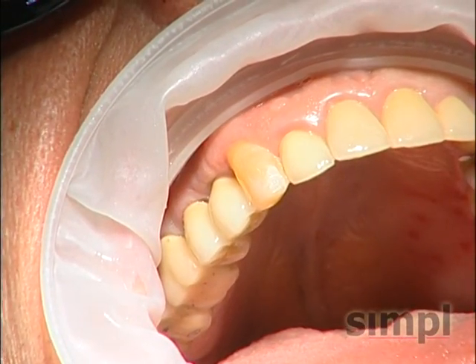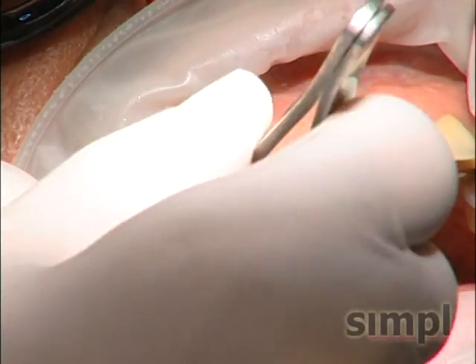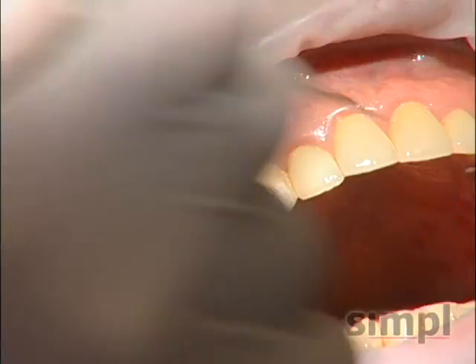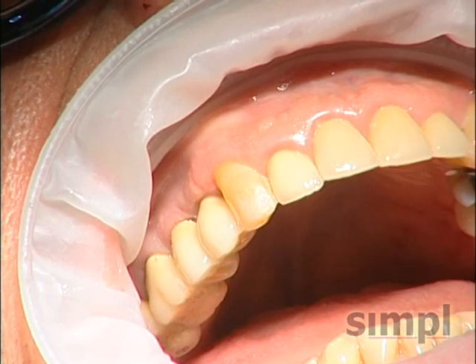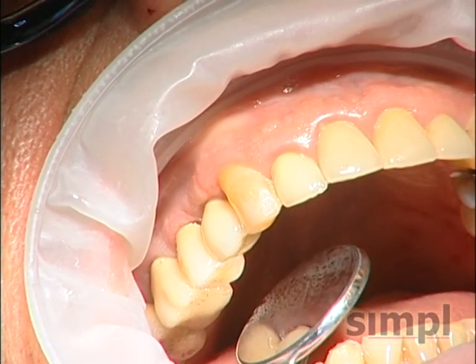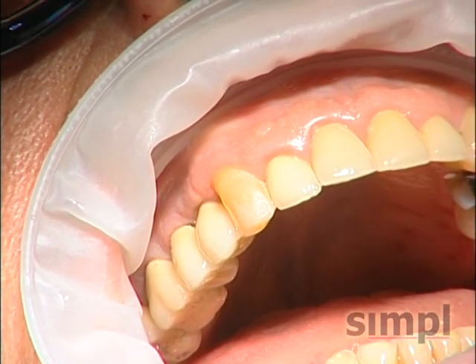And now we're going to check the occlusion. And bite down, close, open, bite down, open, bite down, open. Let's check the bite. The patient is not anesthetized at all during the procedure. We'll see, how does the bite feel? Does it feel like it feels hitting good, or does it feel a little high?